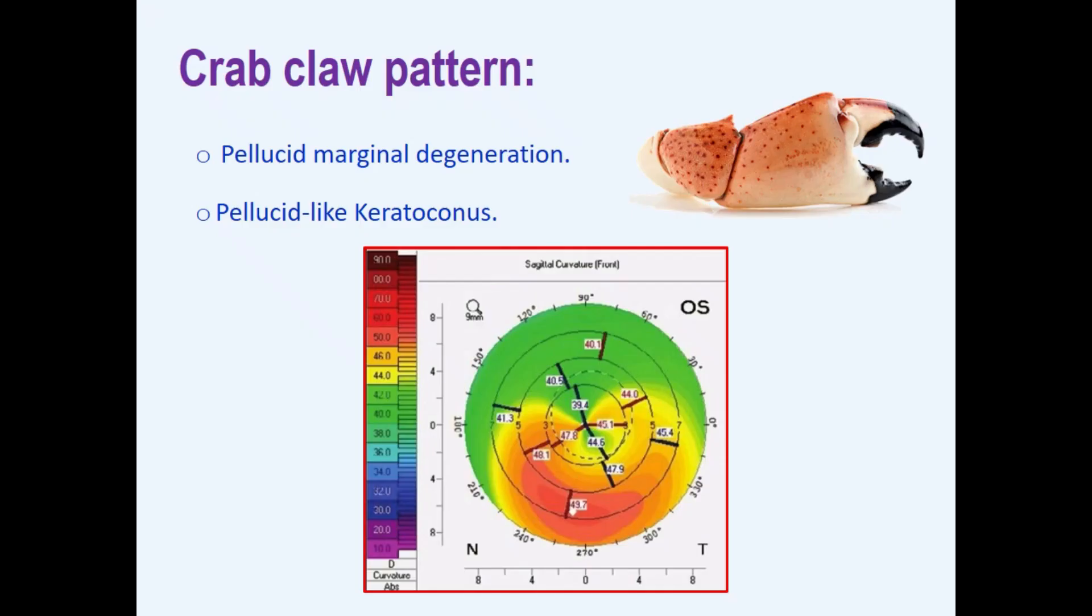What is a crab claw? This crab claw or kissing bears pattern is classically encountered in pellucid marginal degeneration and rarely met with in keratoconus. It indicates large amounts of against-the-rule astigmatism with inferior steepening which creates an appearance of a C letter lying on its back.